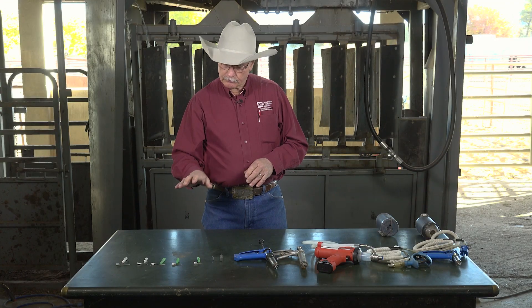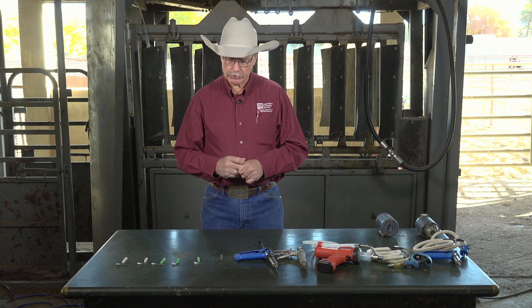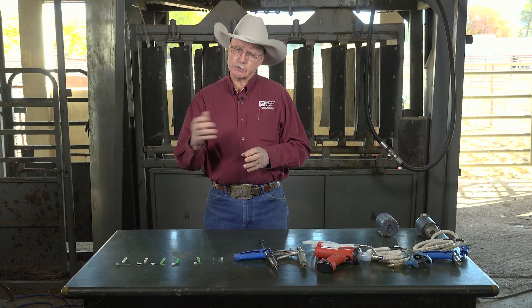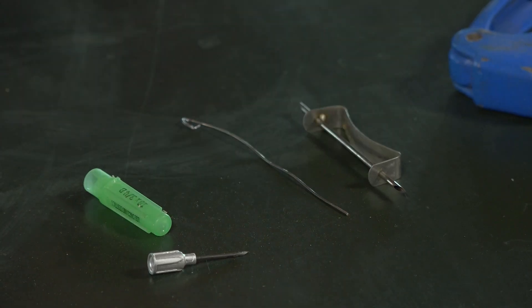When we get ready to go, we need to figure out which needle we're going to use, and then we start into the rest of the equipment. This is a transfer needle. It's used to mix products, and especially when we talk about vaccines, many of our products are made in such a way that we have to mix them with the diluent. So this transfer needle will accomplish that.